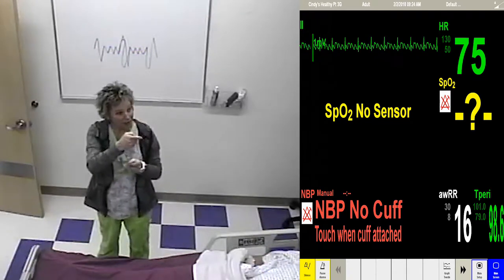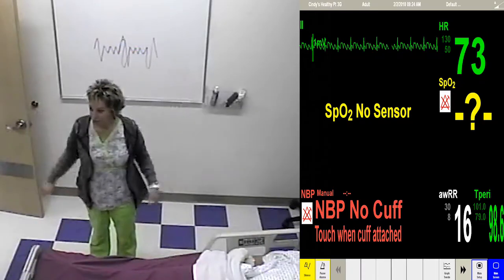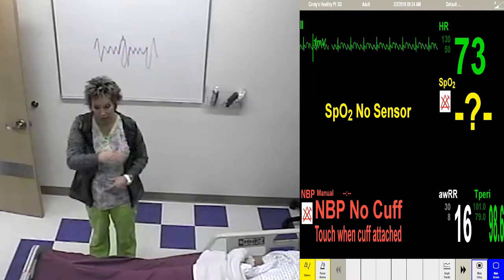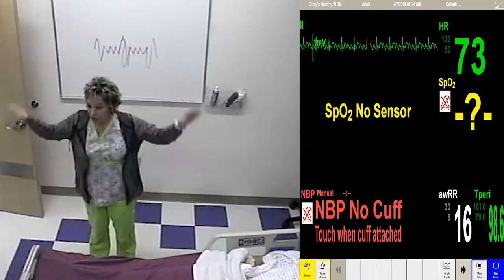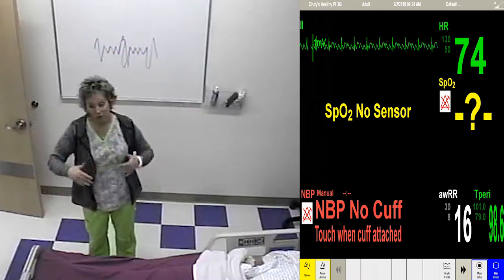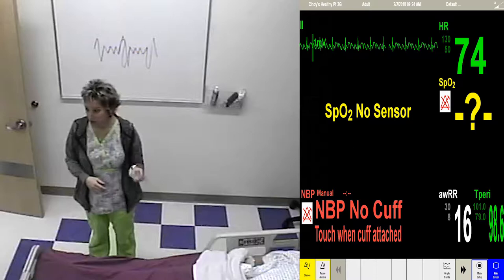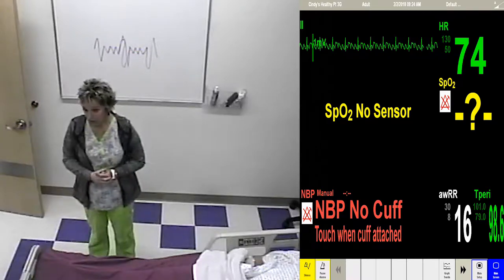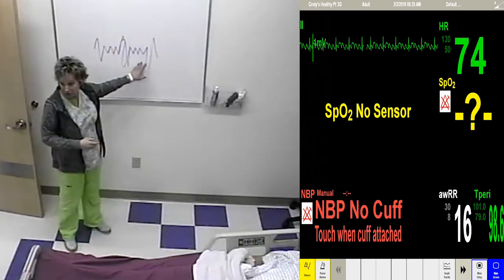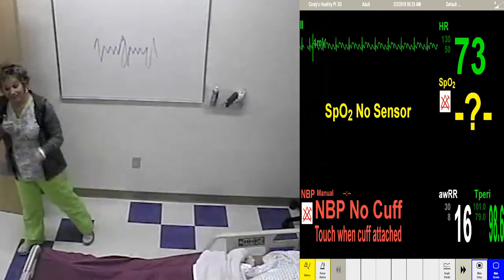So in my mind, I remember flutter. It's like I can see fluttering wings, like a butterfly wing or a bird flying. So picture flapping wings, and what does a butterfly do? It flutters along, right? So that's how I remember this one. Does that make sense? Okay, so memorize the distinct sawtooth pattern. What rhythm is that? Atrial flutter. Heather, say it. Atrial flutter.